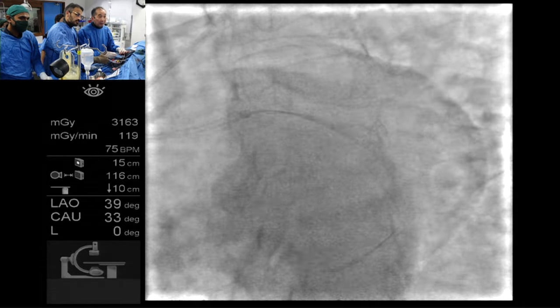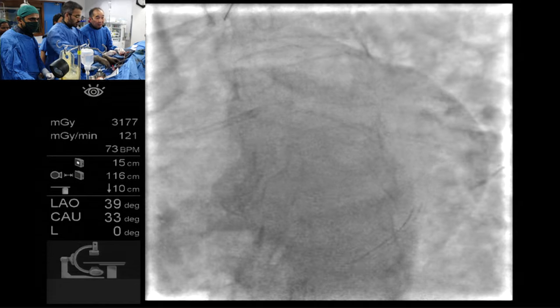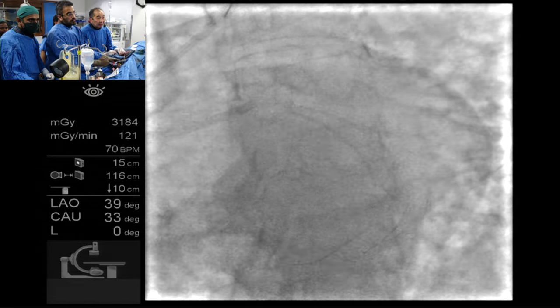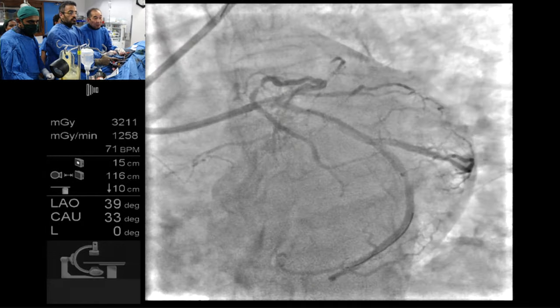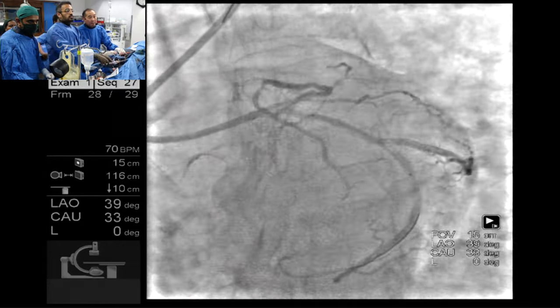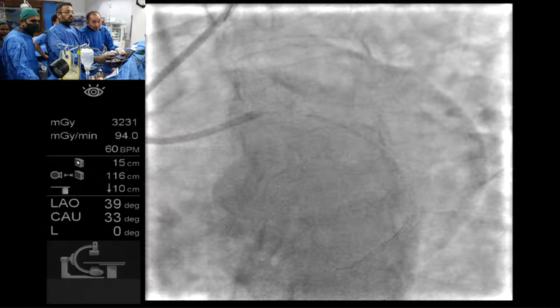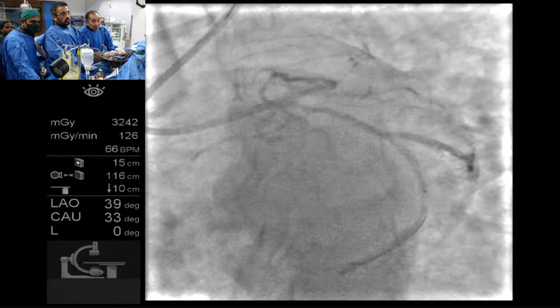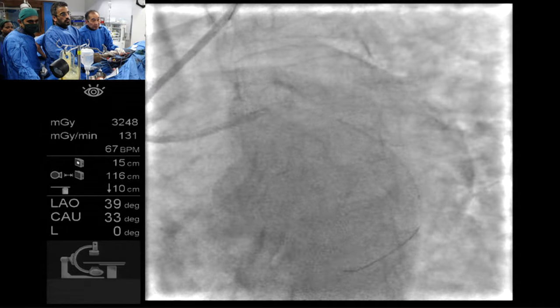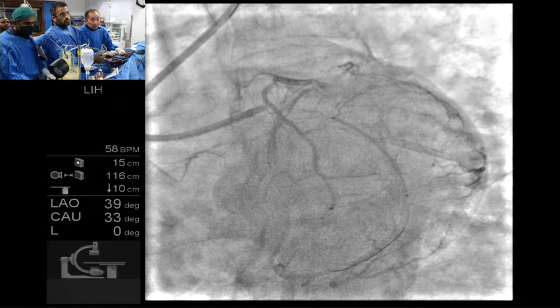So this is a buddy wire, I hope. Okay, now give me a test. We don't need a side branch wire. No, we don't need a side branch wire. Should we take a picture? Yeah. You like this one? I think maybe a little lower, because we anchored so many times with a 3.5. Lower down here? Yeah. Okay, tap up. Looks okay. I think we need to pull back slightly. Just take a picture. Yeah, that's better. Okay, good, go.